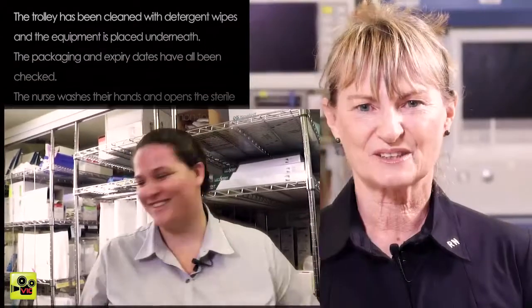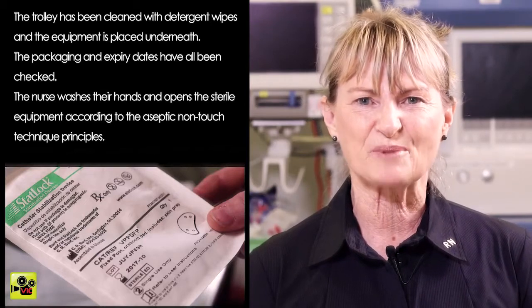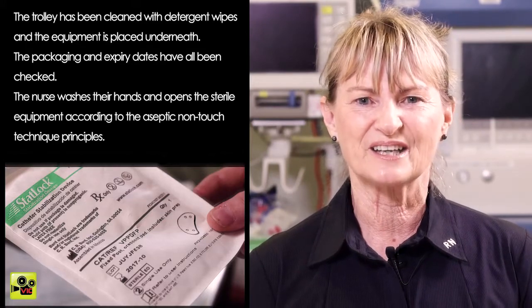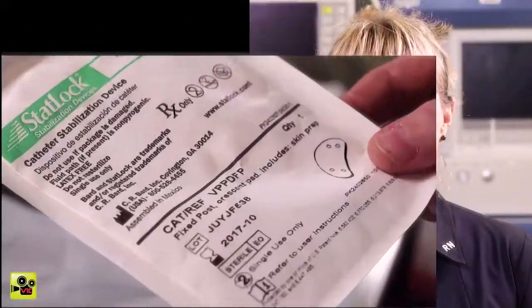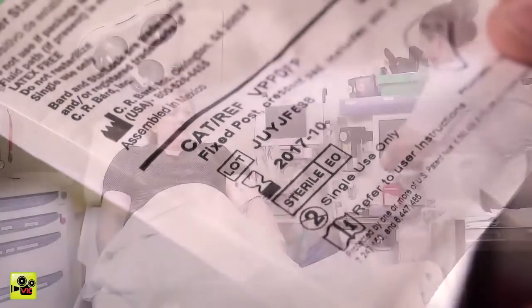Thank you so much. The trolley has been washed with the detergent wipes and the sterile stock placed underneath. The packaging and expiry dates have been checked. The nurse washes her hands and then prepares the trolley by opening the packets according to the aseptic non-touch technique procedure. I always check the expiry dates, then peel open the packaging to avoid contaminating the aseptic field.